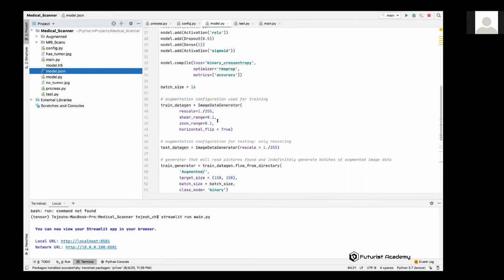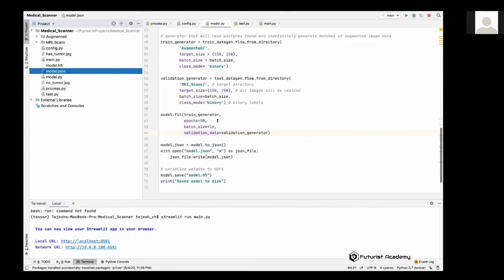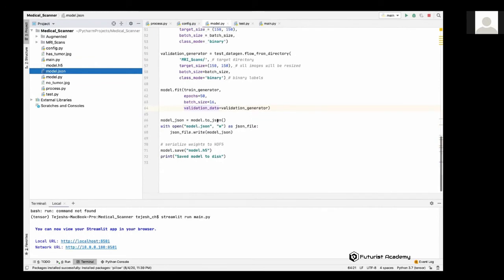And in doing so, I was able to progressively reduce the spatial size of the input representation and make the input representations more manageable. And this also helped me avoid overfitting and ensure that the neural network was invariant to distortions. And then the fourth and final backend operation that's occurring is classification, or a fully connected layer.